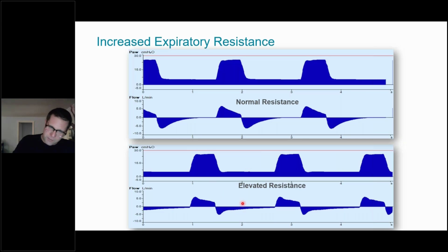And so keep that in mind when you're adjusting your inspiratory time, because you obviously want to allow the lungs to fill as much as possible. And we're seeing more and more of these BPD kids who have these super long time constants because they have extremely high resistance. And so, the 3 to 5 time constants, keep in mind that you're filling not only the circuit, but also the patient's lungs and their airways. And so you may need to use these longer inspiratory times. And in essence, you may reduce your peak pressures or reduce your pressure control level because you're allowing more time for those lungs to fill. And that could ultimately reflect in an improved CO2 efficiency and ventilation efficiency in the end.